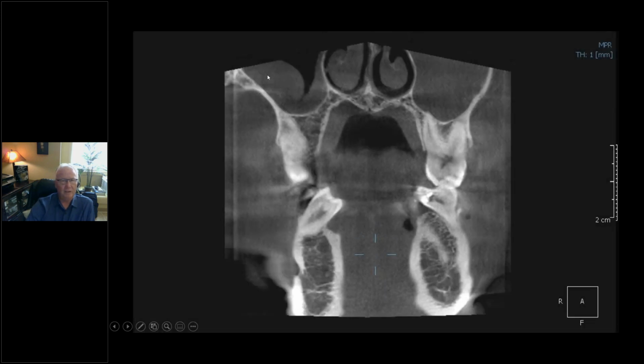The final patient comes in and they have a lot of mucosal change in the right sinus, but the left sinus is totally opacified. Oh, by the way, the tissue around the inferior turbinate is enlarged relative to the left side. There's some little tags over here. So there's some inflammatory change in this right nasal cavity. So this is probably a pansinusitis, or at least a chronic maxillary sinusitis with a nasal component. So it's a rhinosinusitis. And if all of this is going on here, the chances of other inflammatory change going on in the rest of the paranasal sinuses is very high.